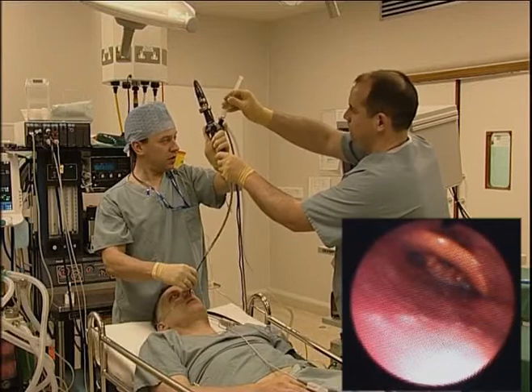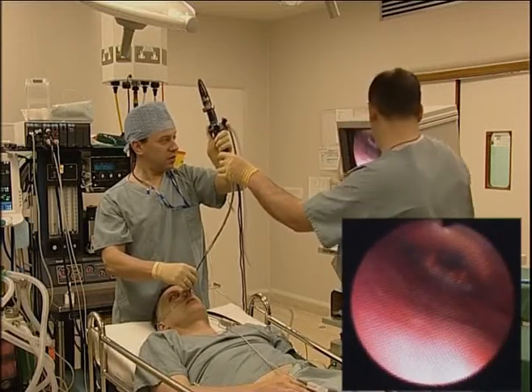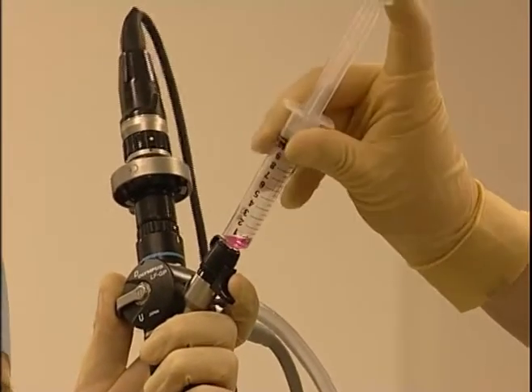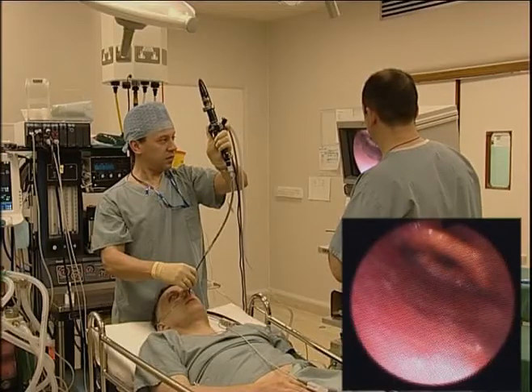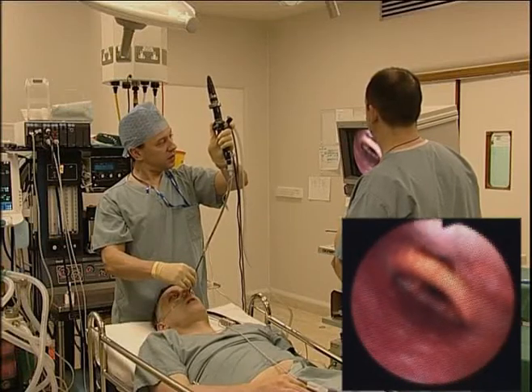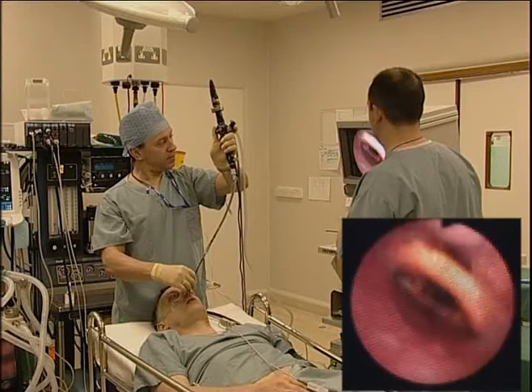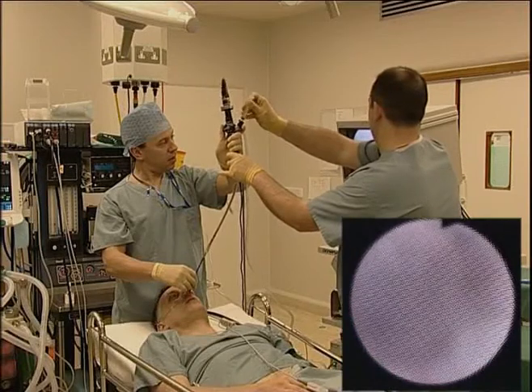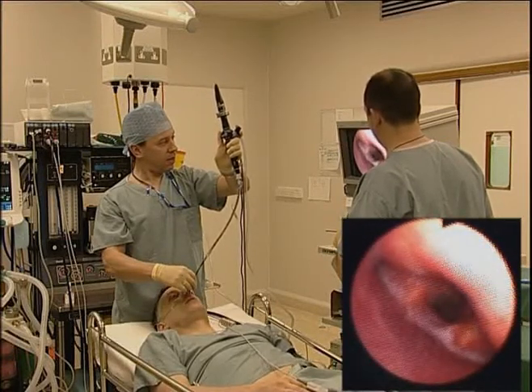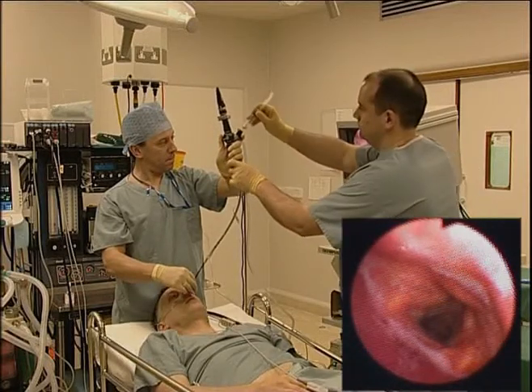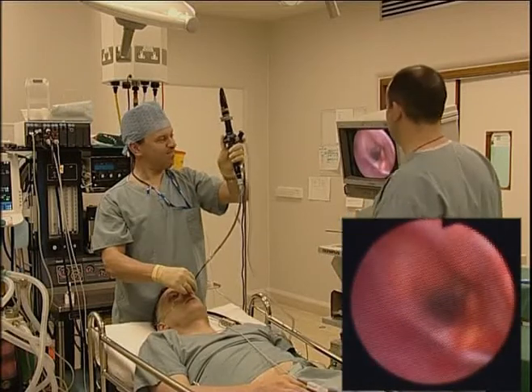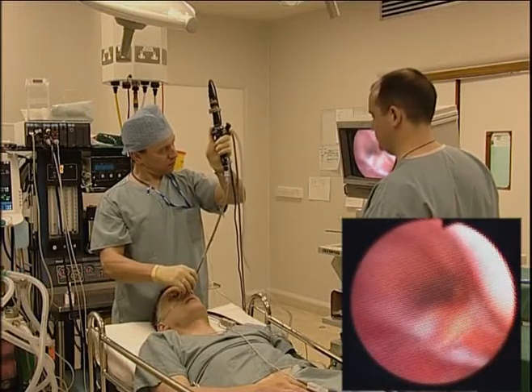At this stage, spray two to three doses of 4% lidocaine, 1 mL each dose, with 4 mL of air to propel it down to numb the epiglottis. Once the patient's larynx stops reacting to the spray of local anaesthetic, you may proceed further under the epiglottis. Spray again on the vocal cords, and if there is no reaction, advance between them into the trachea.